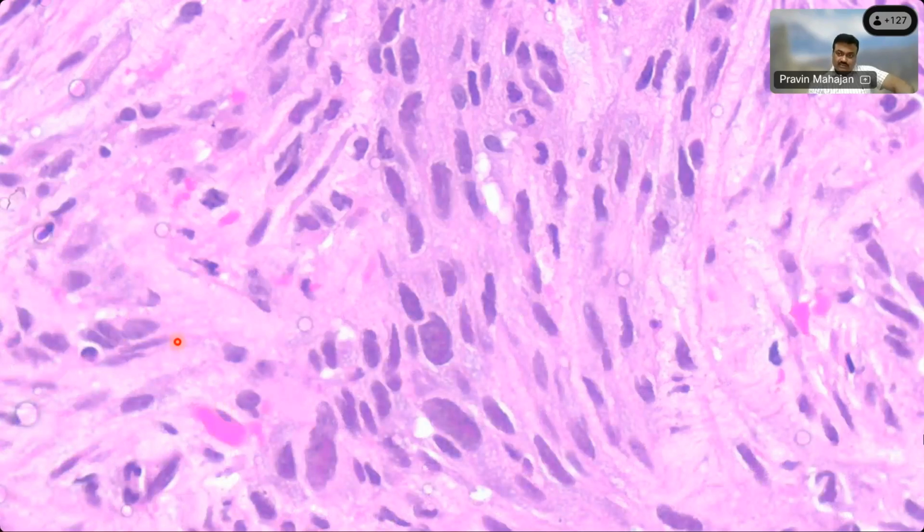Again, this area shows spindle cells which are infiltrating muscular tissue. Some cells do have epithelial morphology. I agree. Most of the tumor has spindle cell morphology, but some cells do have epithelial morphology. I completely agree, and this is what the tumor is.